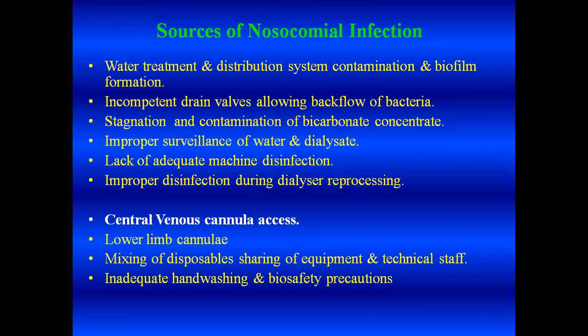It's a convenience for nursing staff and technicians to prepare bicarbonate solutions overnight when the unit is quiet and use them in the first shift in the morning. But allowing a bicarbonate concentrate to stand overnight gives a very large chance for the water organisms, the less fastidious organisms, to grow in that jar of bicarbonate. They then enter the machine during the dialysis, which occurs the next morning, and then colonize the machine hydraulics. And once you have a biofilm which forms within the machine, it can be extremely difficult to get rid of. So, importantly, don't allow bicarbonate to stand overnight.